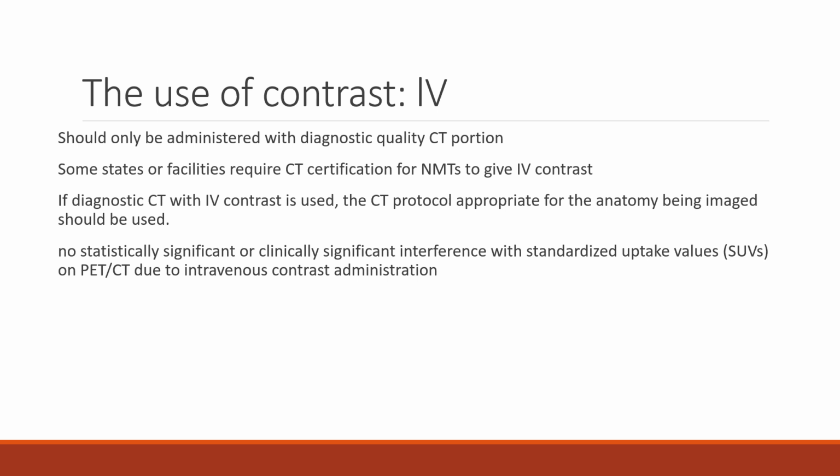It will attenuate a little bit, but there's no significant interference from that. Some places will choose to do the PET before they do the diagnostic CT portion with IV contrast, just to make sure that that contrast doesn't interfere with anything. But there's a couple different protocol variations for that.